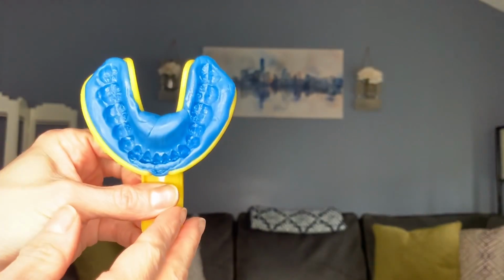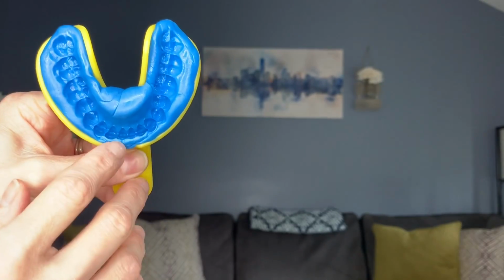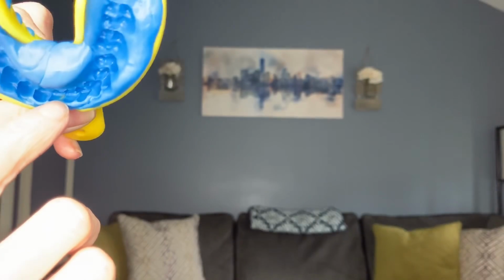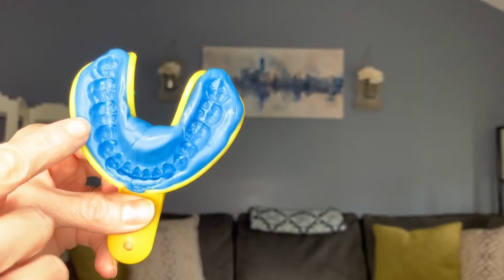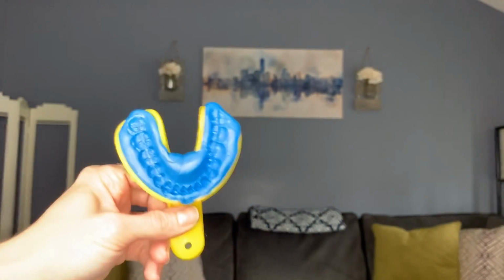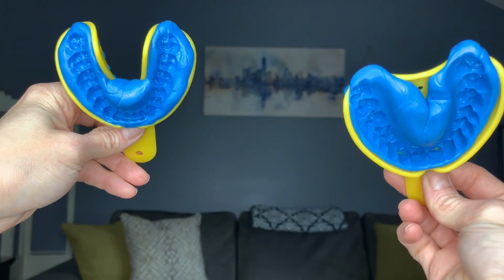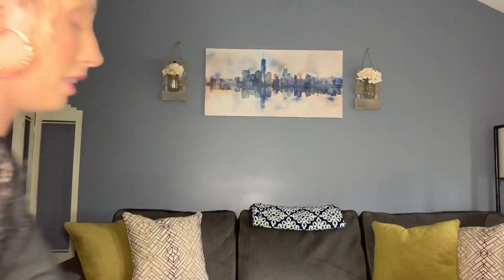You can see here that I needed more pressure for the lowers, which I did apply, but again, it broke through, but I needed the pressure along the backs so that it could get more of my gum line. So you've got to put the pressure on there, but you've got to do it just right. So this here is the first set that I did that was incorrect. Pretty self-explanatory on why I didn't get those right the first time.